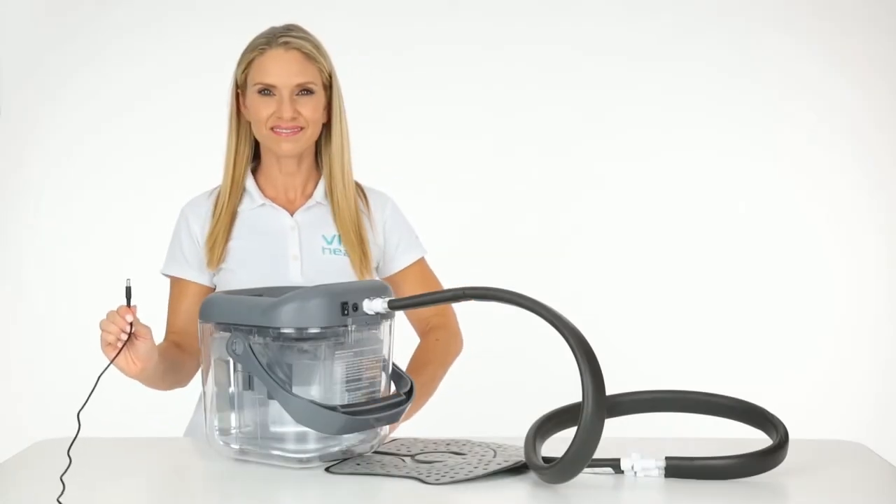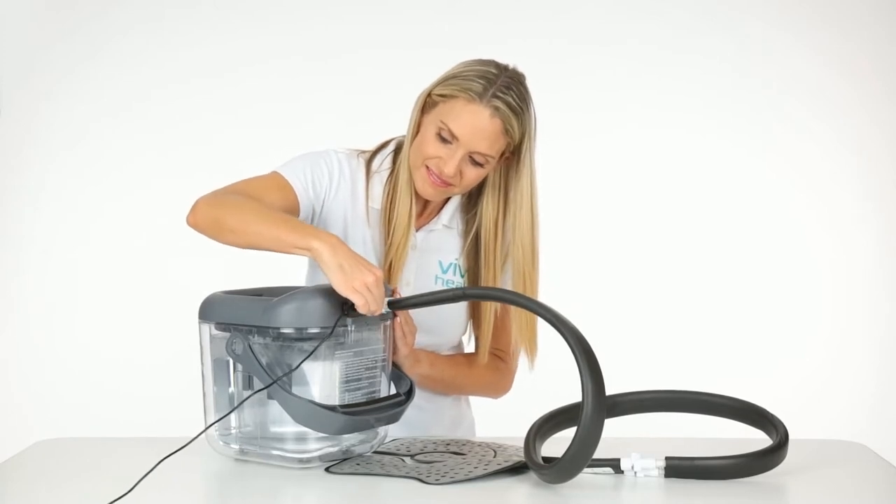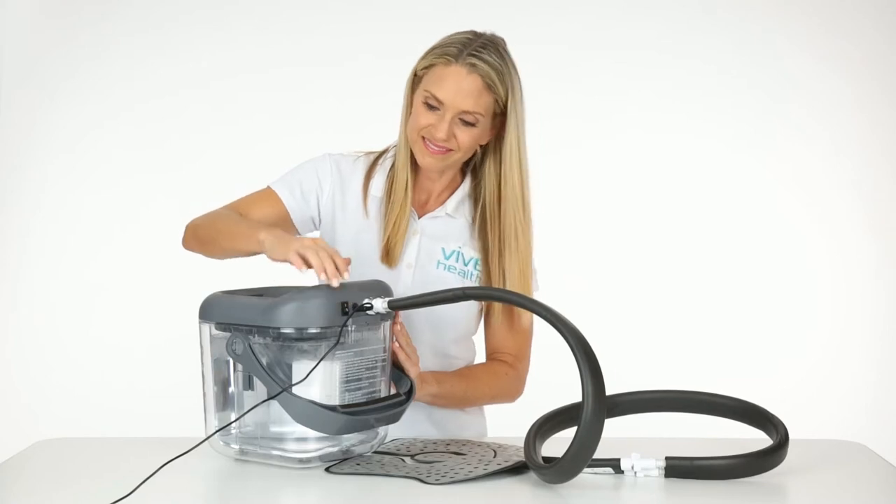To power the device, plug the power cord into the lid. To turn the unit on, flip the switch next to the power plug.